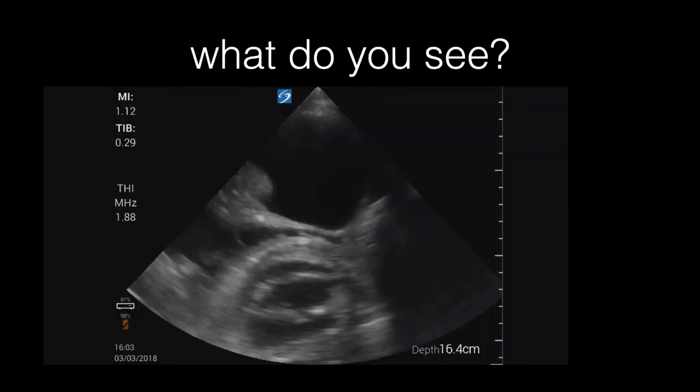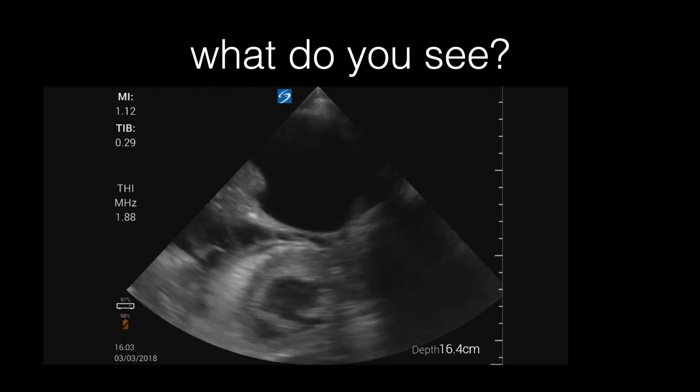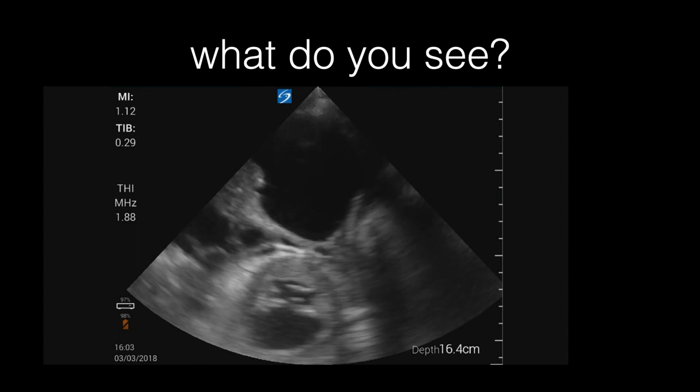Just again another example of an effusion. Again, you're seeing the heart here. Normally you would never see that through the chest wall, but because of this effusion, you can see the heart.